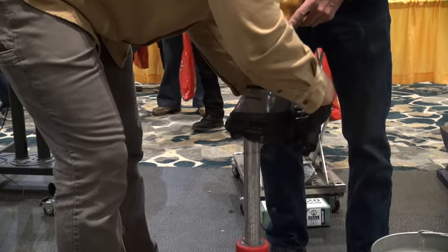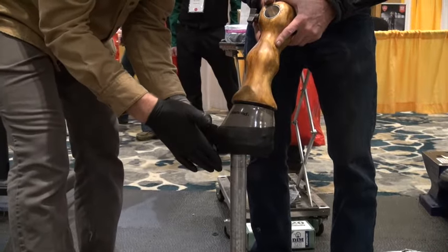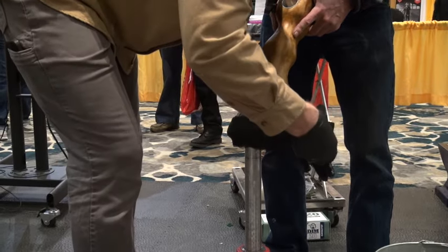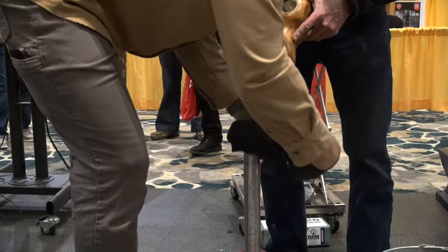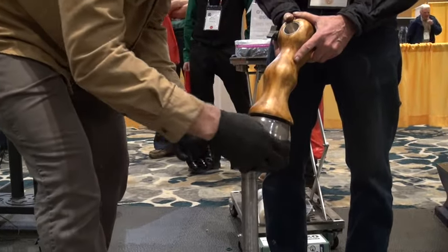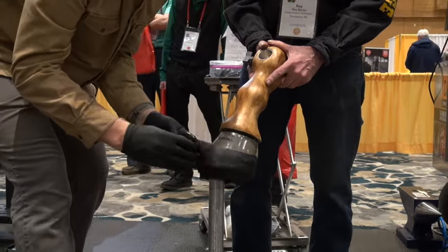We've got the 3-inch foot probe casting tape. Sometimes I'll use a 2-inch on smaller feet — it just kind of depends. I don't want to go up over the bulbs. I'm going to probably cross the bulbs a little bit and I'm going to have to go in and trim that away. It's a hard material and the bulbs are soft, so it's going to cut into the bulbs over the course of the casting, so I'm going to have to cut that away so we don't create any problems.